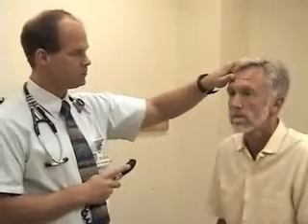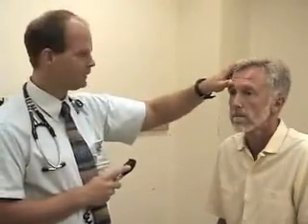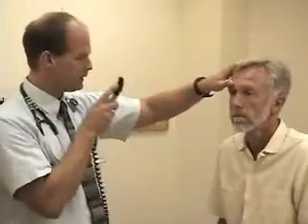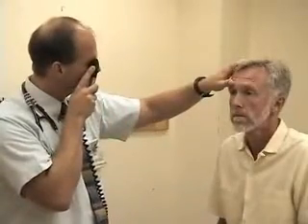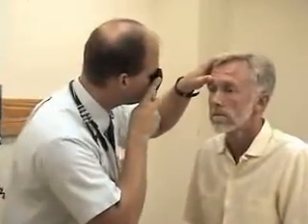If you can find something at about your eye level, I'm going to have a light that's going to be kind of bright in your eyes — best you can just stare right past me. I'm going to use my left hand both for my own proprioception and to steady the patient's head. That way, if I bump into something, I'm going to bump into my thumb and not his eyebrow. I'll get back here and check for his red reflex, and then gradually come in. If I'm about 15 degrees from the midline, I should come in right on his optic disc.